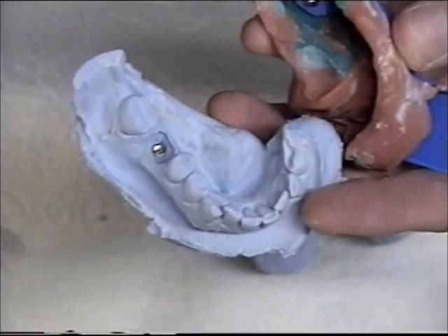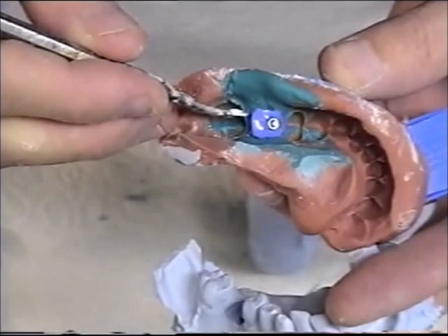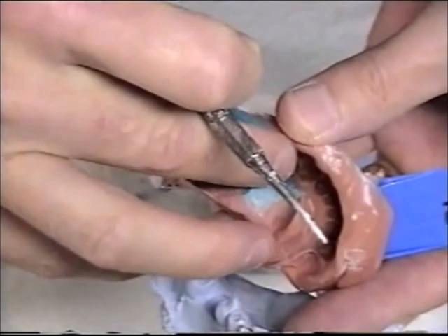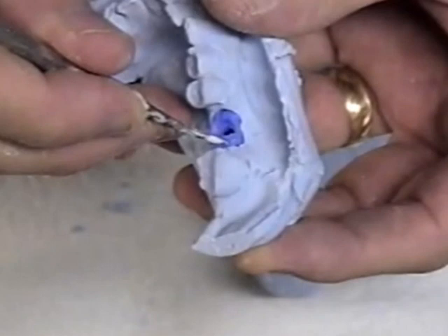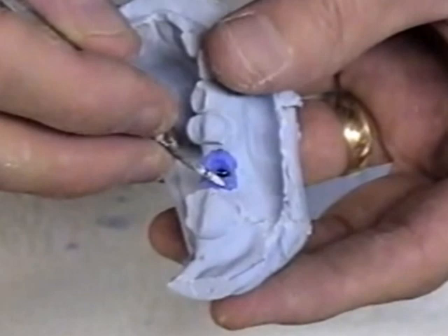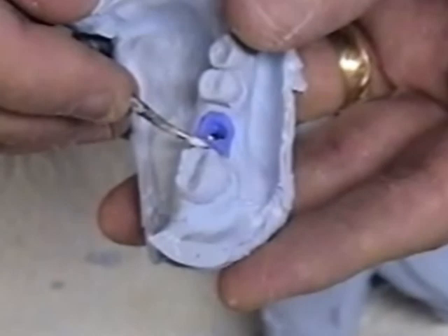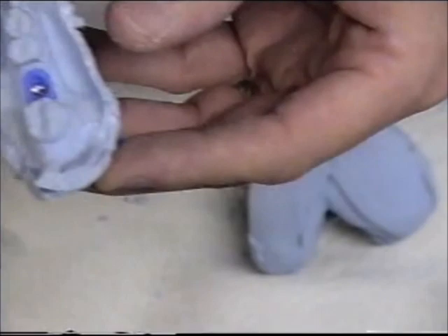Okay, you can see the cavity where the soft tissue is still on the impression here. Since I have used a release agent, it will easily come off, separate from the impression material. And I can place this into my model. Looks nice.